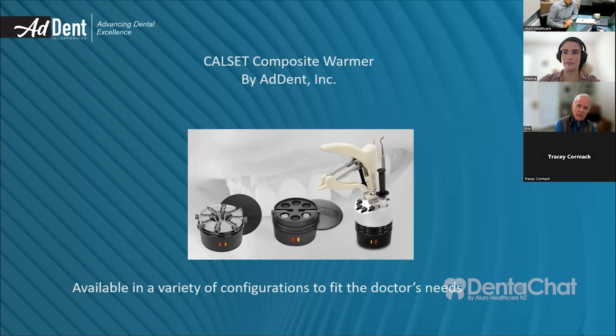Okay. Well, as I said earlier, two reasons. One, the composite gives you a stronger bond than luting cement. Secondarily, if you look at the margins under a microscope, and the margin is not absolutely perfect, I'm talking about high magnification, there's a little space between the veneer and the tooth. That gets taken up by a composite, which becomes a restoration. It's not going to wash out. It's much stronger than the luting cement. The luting cement has a low filler loading, and it's not as strong.